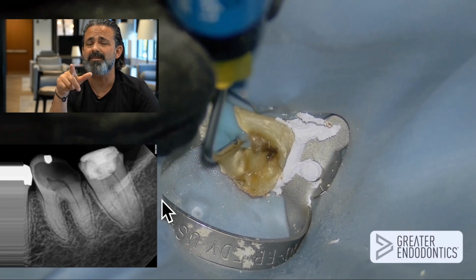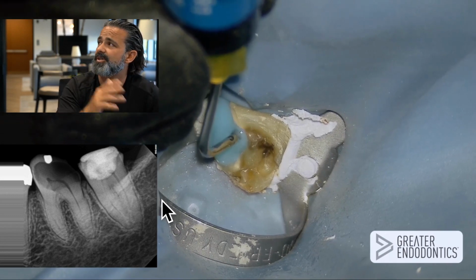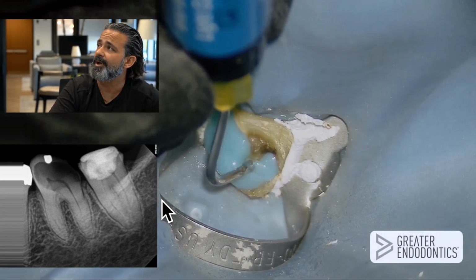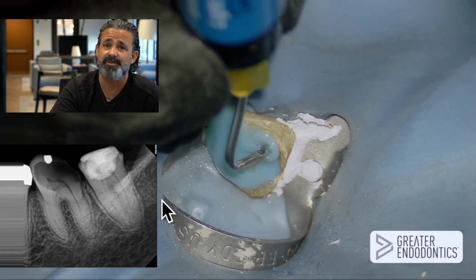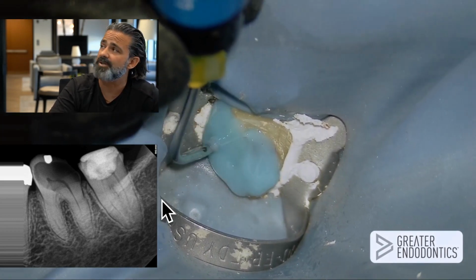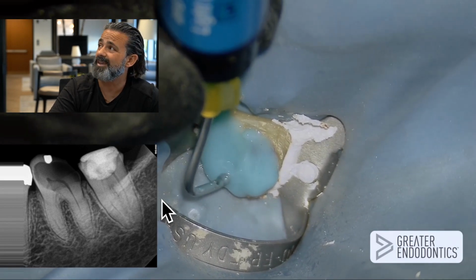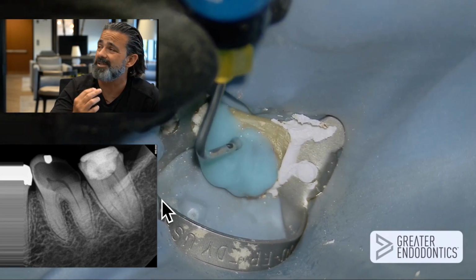The nice thing about blocking yourself out with caulking in a pulp exposure scenario is it doesn't hurt anything to do it. It's easy to remove, but it's a breadcrumb. It's another breadcrumb because it's easy to see under the microscope something white sticking out in a red space. And we saw how hyperemic that was, so it's not going to be hard for me to re-access this. And candidly, the Soundseal is really soft stuff. It's kind of rubbery and gummy and soft.